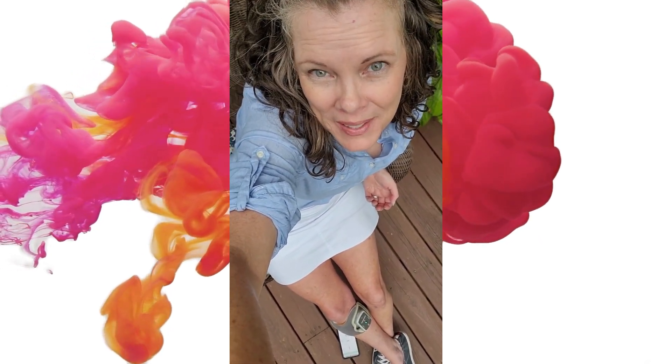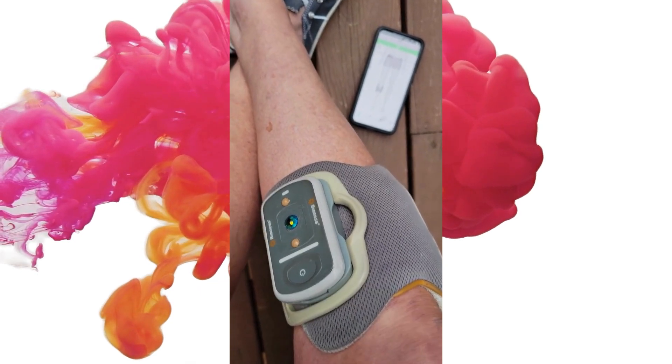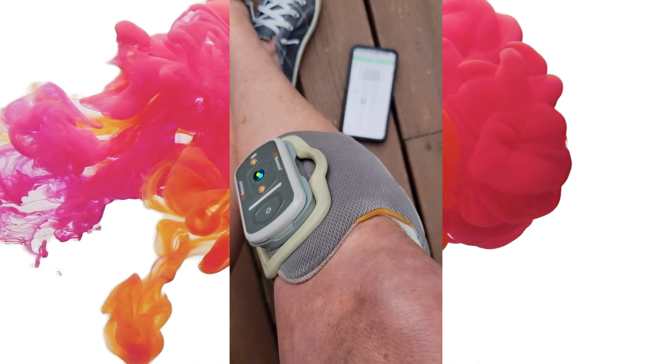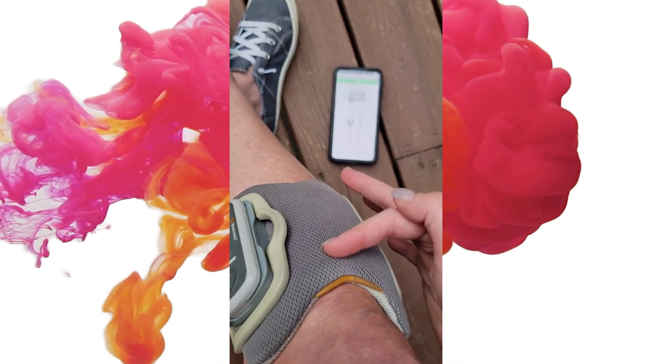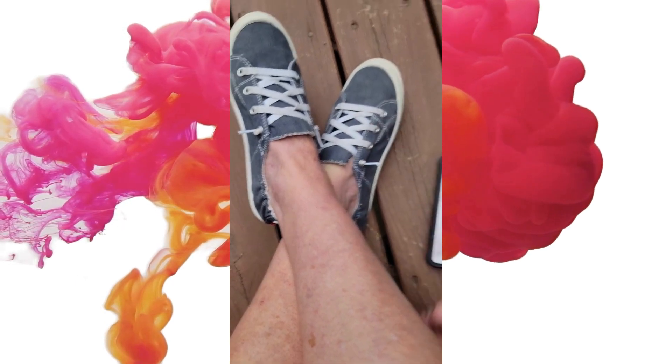Hi there, I'm the Mrs. with MS, and I am excited to share with you my Bioness Go and how this device helps me to walk better. This is the device on my right calf. It is a Bioness L300 Go, and it's a neurostimulator that will send messages from electrodes in the cuff down my leg to my toe to make my toe lift.